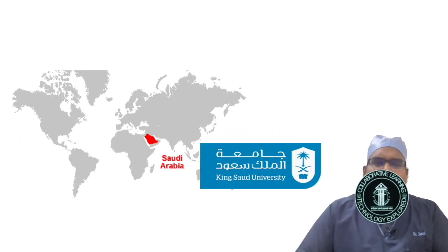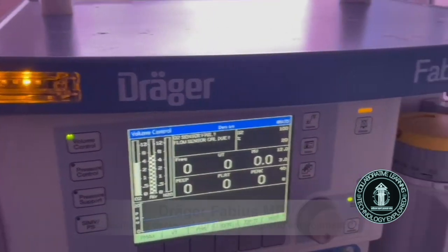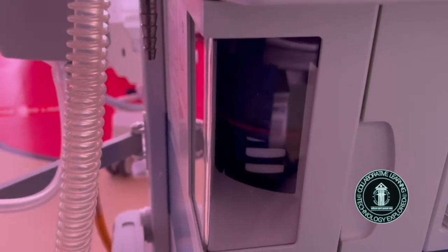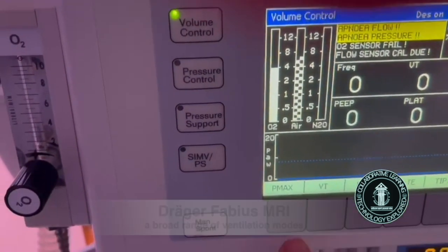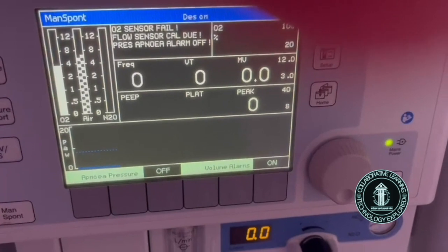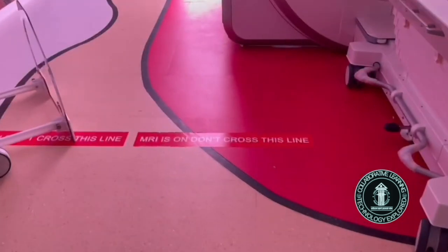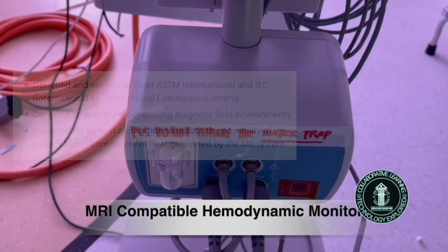Before winding up, let us go across to Riyadh again to see the MRI compatible anesthesia workstation and MRI compatible monitoring gadgets with Dr. Bilal. You can see the piston driven ventilator integrated and a broad range of ventilation modes depending on the patient you cater to. It has an integrated compact breathing system also with this workstation. This is a view of the MRI compatible hemodynamic monitor also.